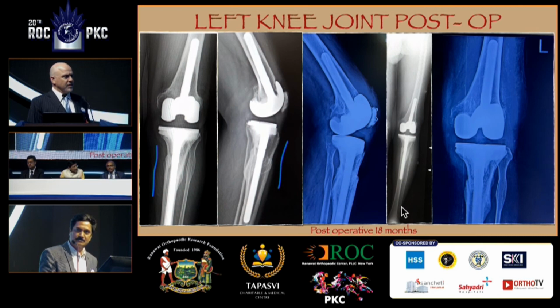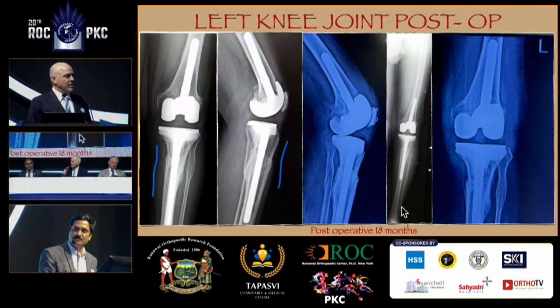So, a vertical fracture, and the reason they're worried about it is because in the intraoperative photograph, you could see the wires on the undersurface of the patella. So that's why they're worried, I think. No, I understand that. But my point is, if you're going to fix it that way, I would have just left it. That might have been a better solution than having a wire touching the trochlea. That's going to cause a major problem.